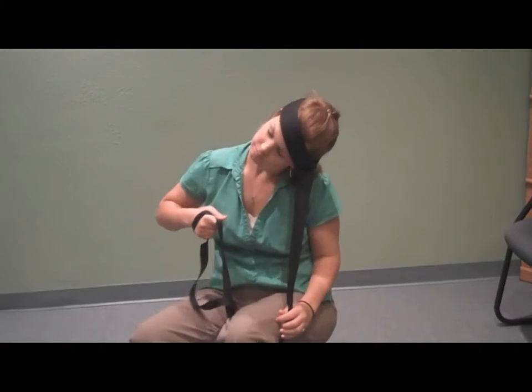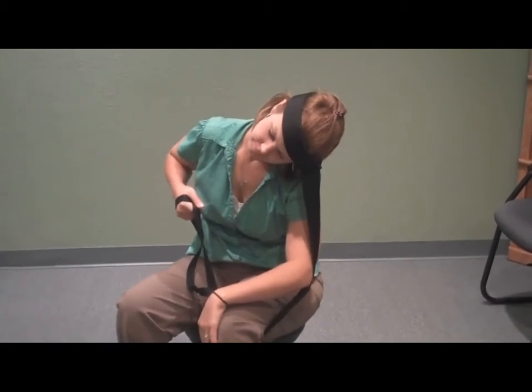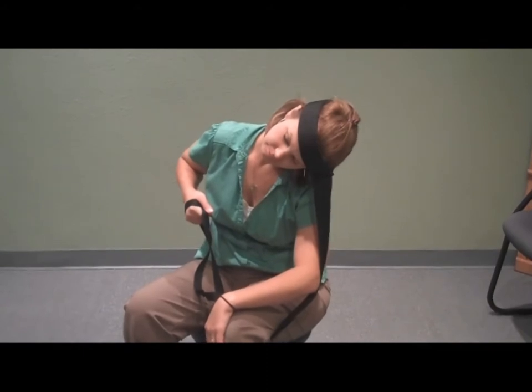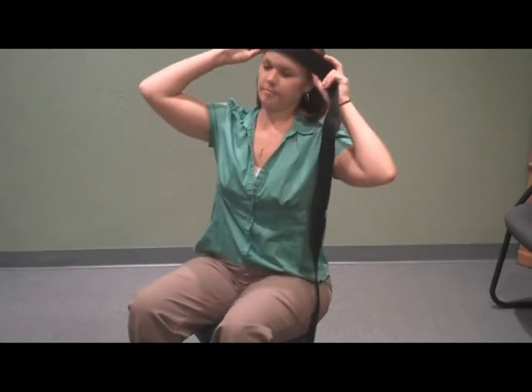You can kind of use your elbow to help push it out just to get a little bit more stretch. You can see — and you'll be able to feel this — she will be feeling that stretch on the opposite side of her neck. Then after she has held that for 40 seconds, she'll release it.